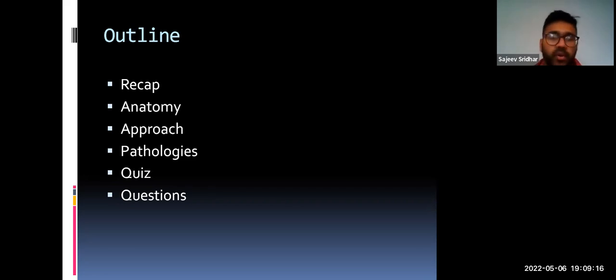So a basic approach will be gone over, and then in this lecture we'll be going over a couple of pathologies, but the bulk of them will be covered in the next one. As well as that, there will also be a quiz at the very end, and you can ask me questions at any time, and I'll try my best to answer them. Okay, right.